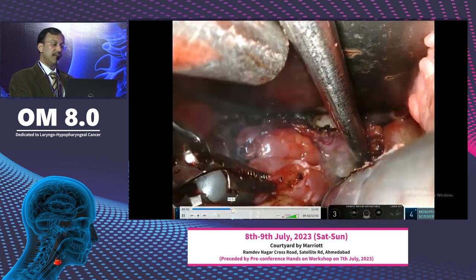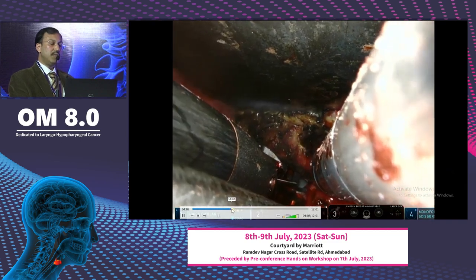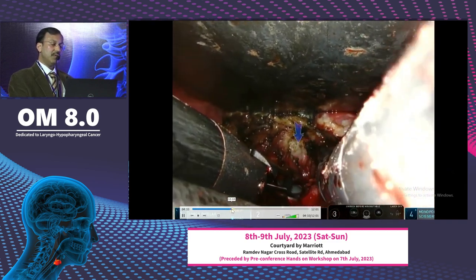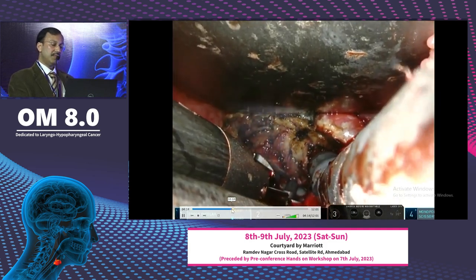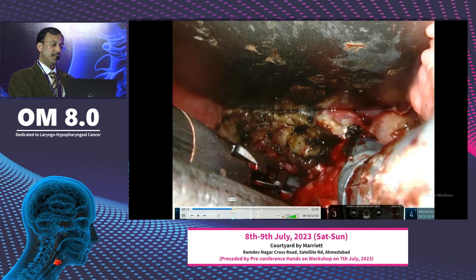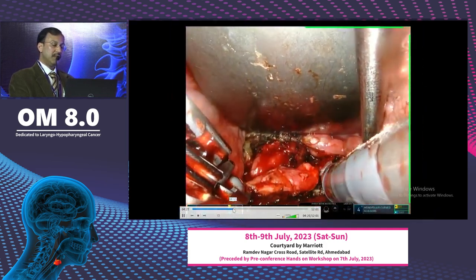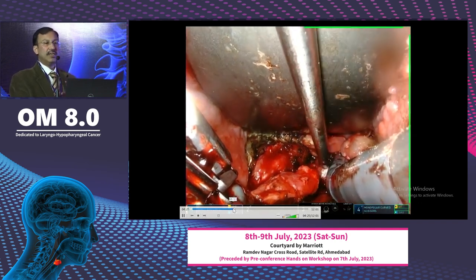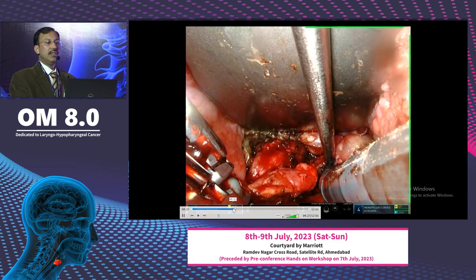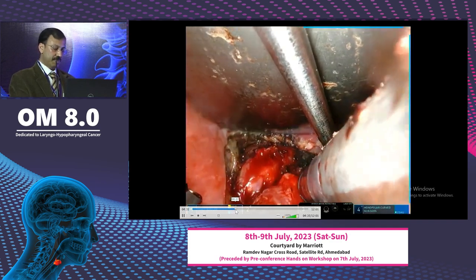You can see the lesion there, and then the inferior cut is given here, and then you come over the thyroid lamina. So you can take out the perichondrium over there, and this forms the base. He had another lesion on the right AE fold also, that also we resected. So he had three primaries in the pharyngeal area, laryngo-pharyngeal area.